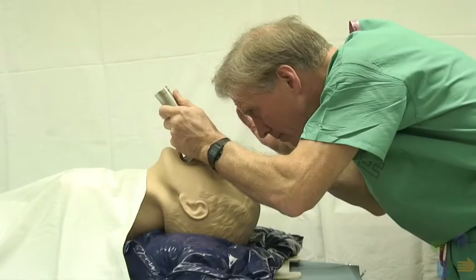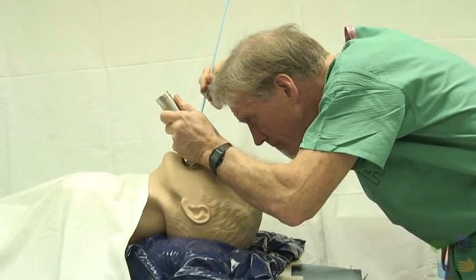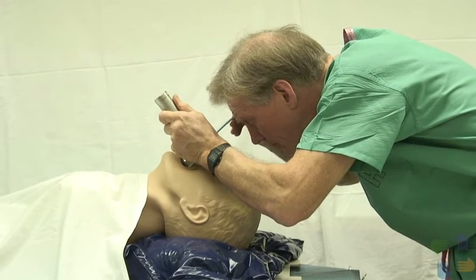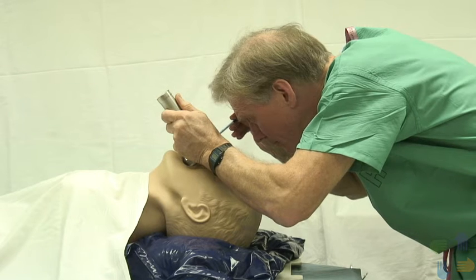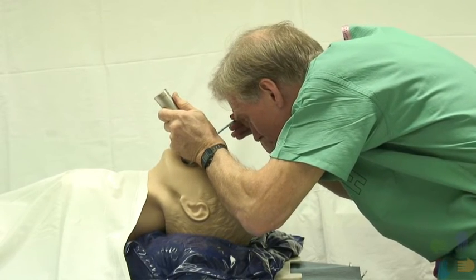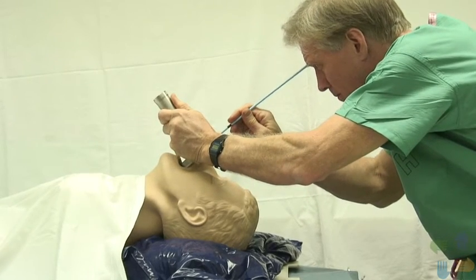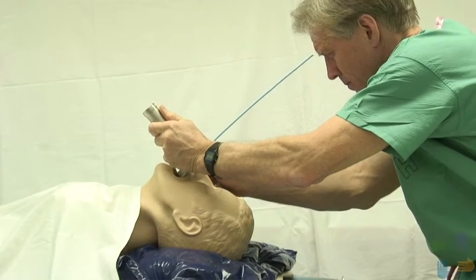If you're able to visualize the laryngeal inlet but are having difficulty placing the bougie into it, it may appear as though the bougie is too soft or floppy to access the airway. This is usually not the case. Far more likely, the operator is standing too close to the patient, and when the bougie is inserted, it is inserted at an angle relative to the line of sight and results in an inability to get the bougie anteriorly enough to access the airway. In this case, merely stepping back away from the patient and lining the bougie up with your line of sight should result in easy passage of the bougie into the laryngeal inlet.